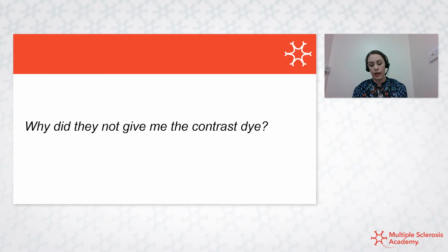Although, of course, you can have asymptomatic lesions or active lesions without knowing about it. And also, if there's a monitoring scan for PML, it's not necessary to always do contrast dye or gadolinium.